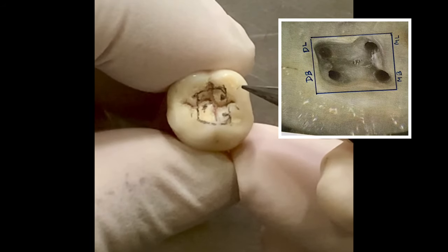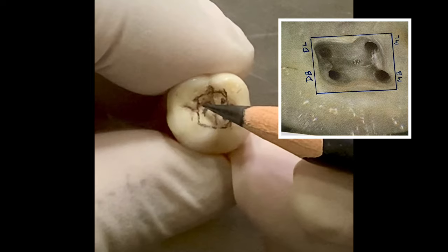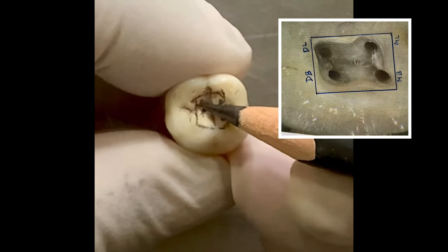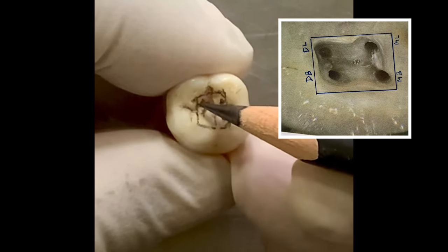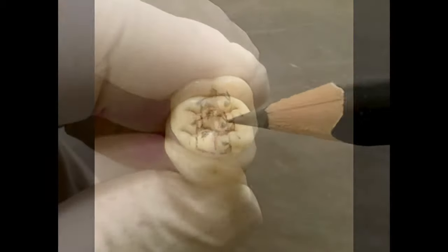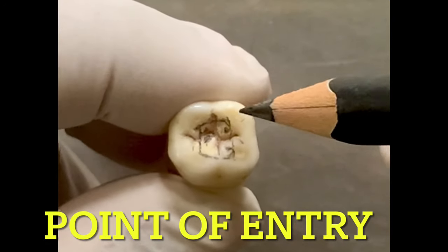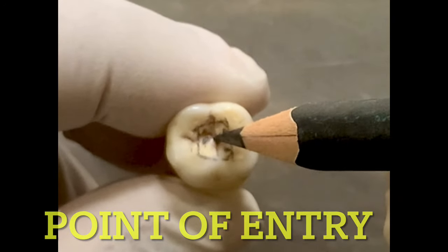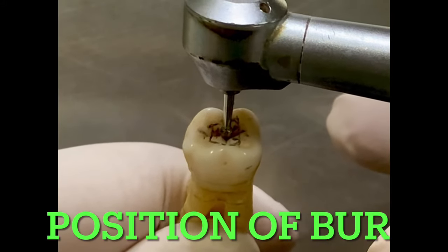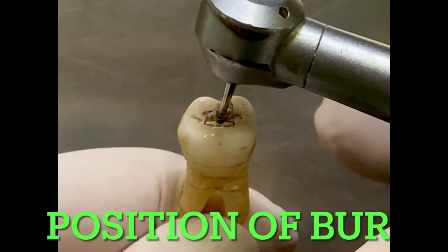Our access cavity could have been triangular in shape, but it is not, because we have to widen on the distal side to explore for the second distal canal. When that is present, the shape becomes square. The distal orifice is the largest and oval in shape. Therefore, we begin our entry by directing the bur towards the distal side — we place a round bur in the central pit and tilt it slightly distally.